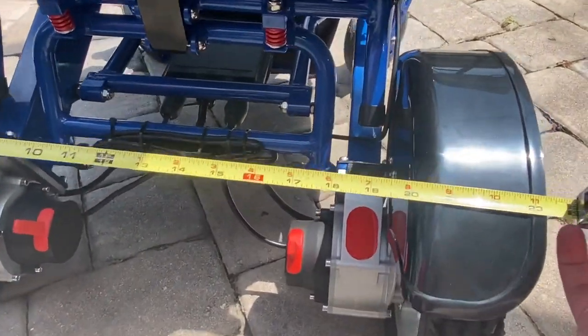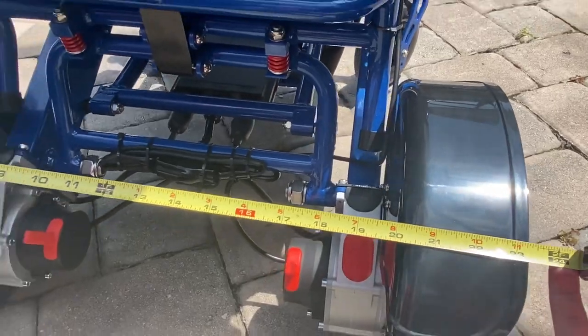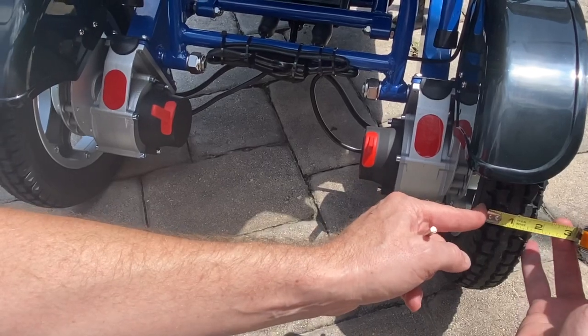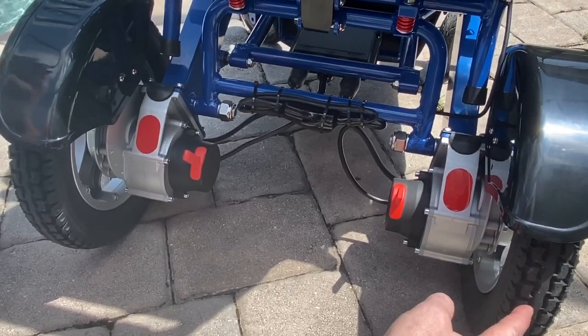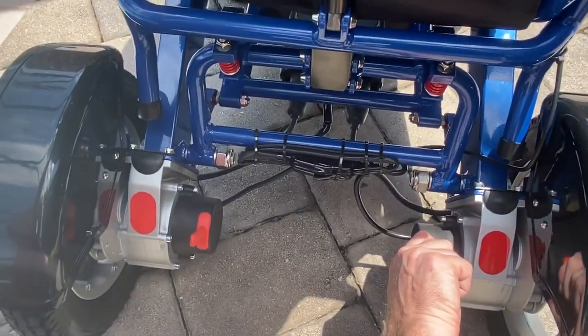Looking at this chair, it is about 23 and a half inches of total width — that's the doorway clearance you need. The rear wheels are each 12-inch diameter and about two inches thick. You can see tread on these non-flat tires, so if you roll over a row of tacks, don't worry — there's no inner tube and they're not going flat.